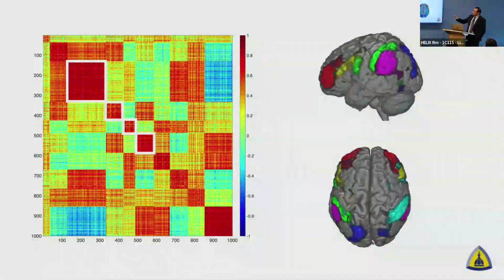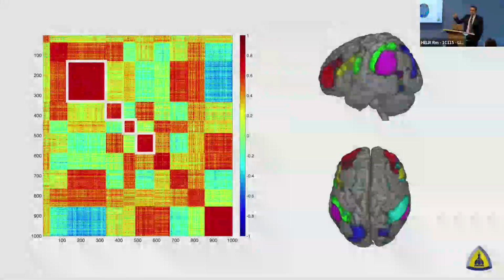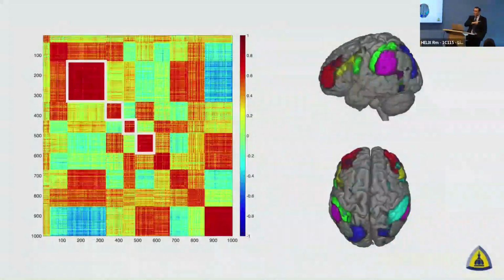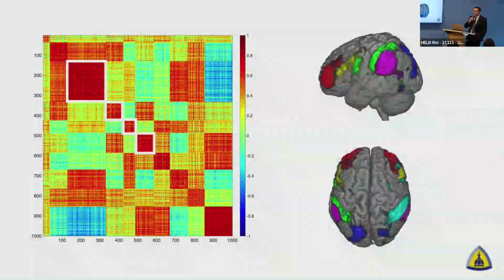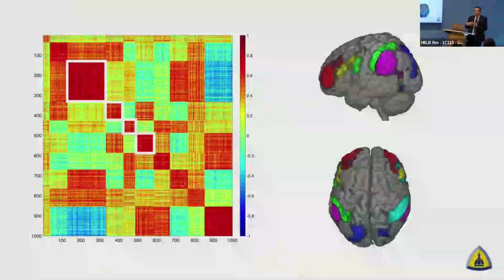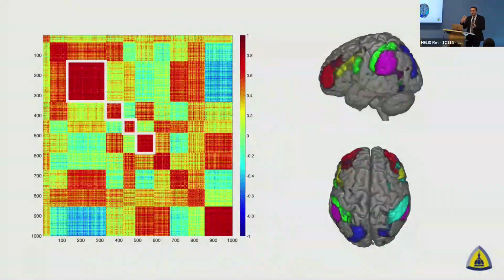So essentially, the squares on the diagonal end up representing different, what we call intrinsic brain networks that all have a similar function that are kind of working together. But again, going back to the principle of the entire brain working in sync, there's some kind of calculation you can make with the entire brain, but those square areas tend to have much more convergence within themselves. And when you map that out into the brain, they actually represent systems in the brain.